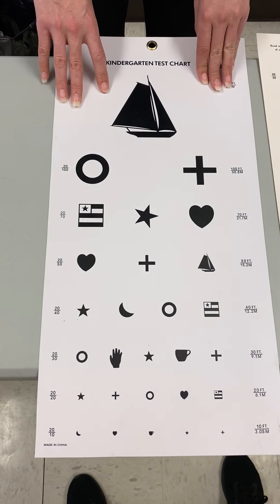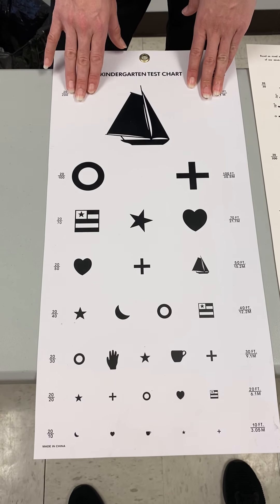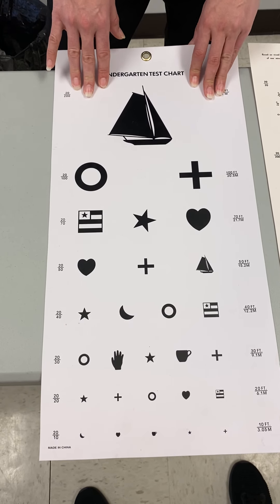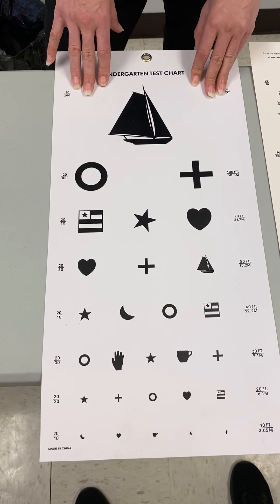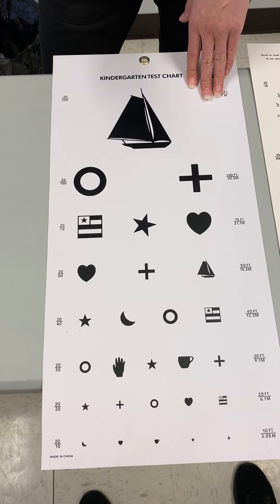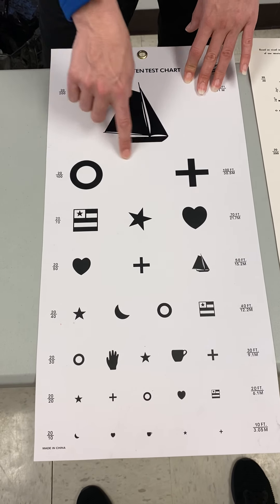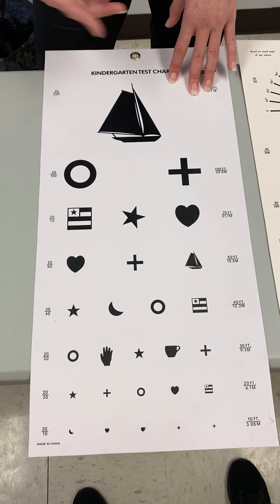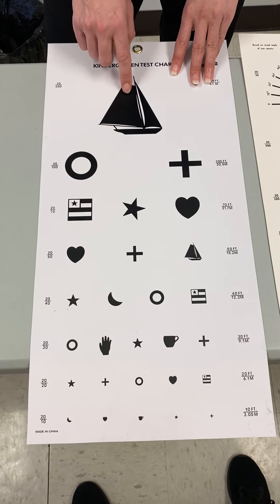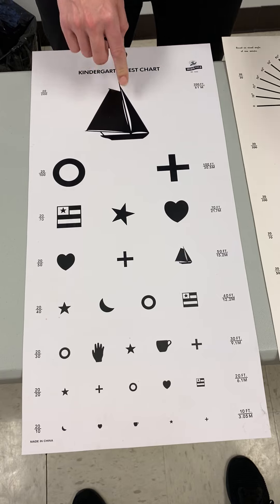Another alternative for children who don't know their alphabet or for non-English speaking patients is a chart with shapes or symbols. This one is not used as often as the Snellen Big E chart because of the variance in symbols — not everybody calls them what you'd expect. For instance, if someone said 'boat' instead of 'ship' for one image, that may be acceptable, but it's not as accurate as the Big E or regular Snellen chart.